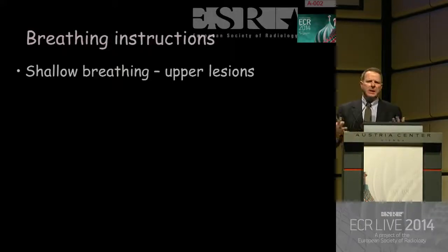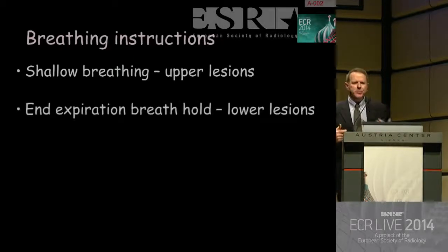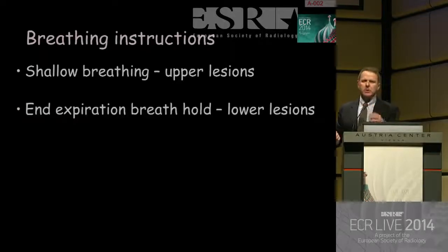They're not sedated like when you do a TIPS. You know, you do a TIPS procedure, they're sedated. They don't care. Shallow breathing for upper lesions. They don't move very much. I prefer end expiration breath hold for lower lesions. Take a small breath, blow the air out, stay still, and you check it a couple of times.